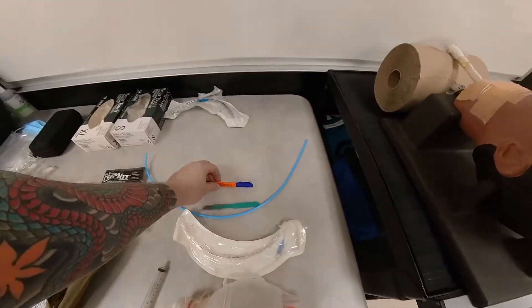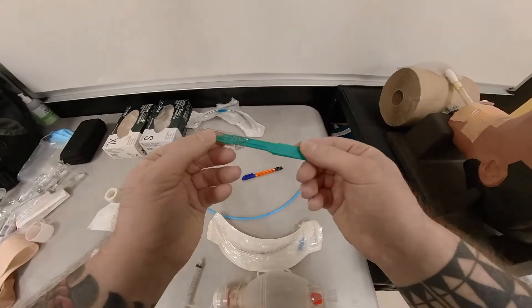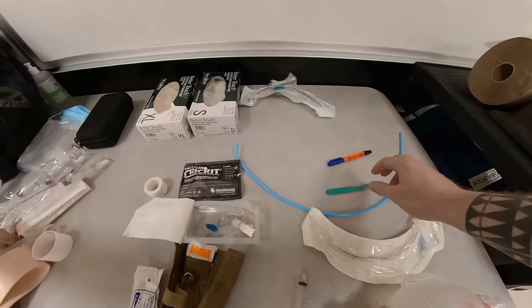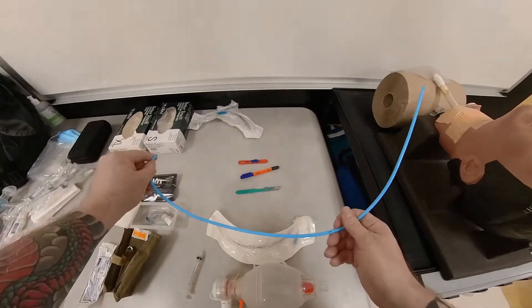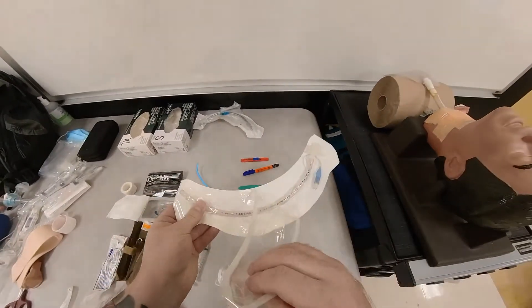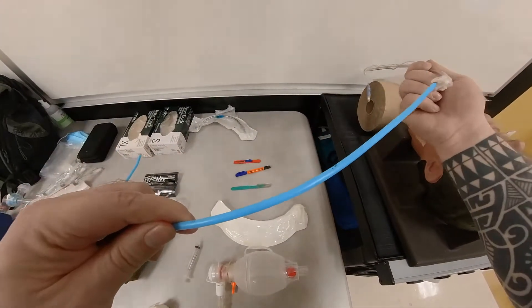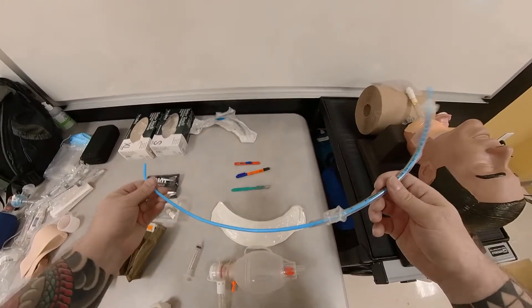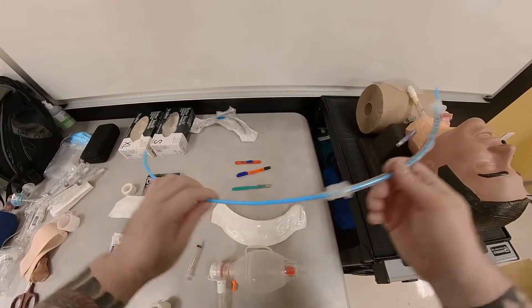So what equipment are you going to need? You're going to need some sort of a marker or Sharpie — this is used specifically to mark on the skin. You're going to need a scalpel — here I have a scalpel from a FAST cric kit, but you could also use one from a central line kit. You need a gum bougie with a Coude tip, and you need a 6.0 endotracheal tube. I advise you to already pre-thread this when you start the procedure, so that when you're performing it, you don't have to go through that step.